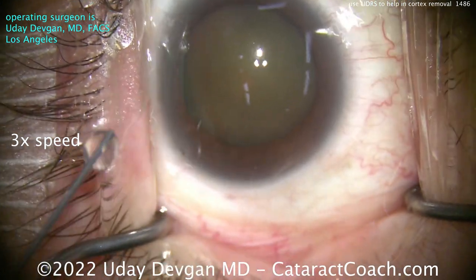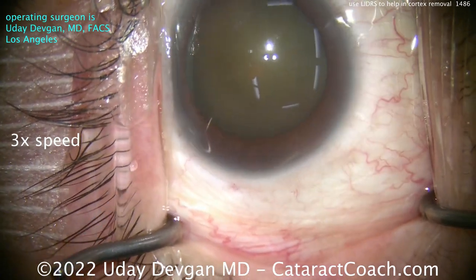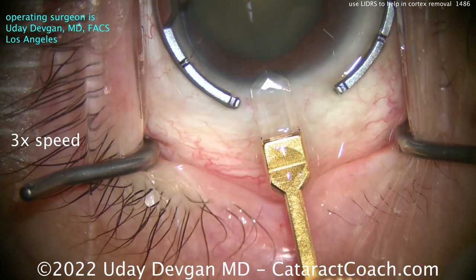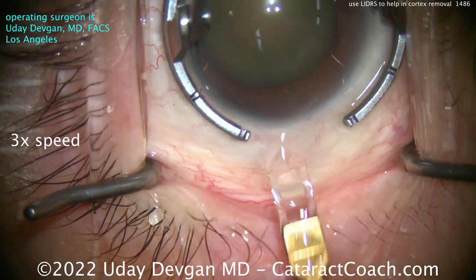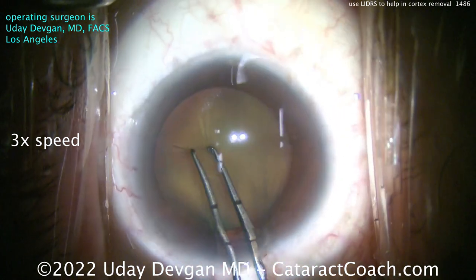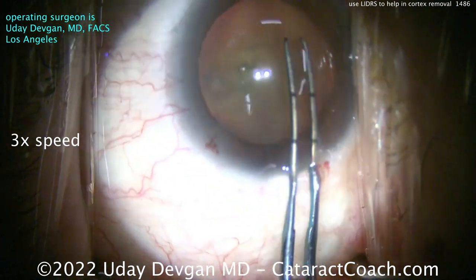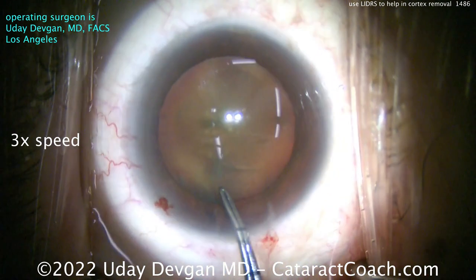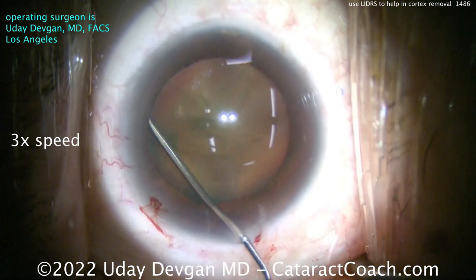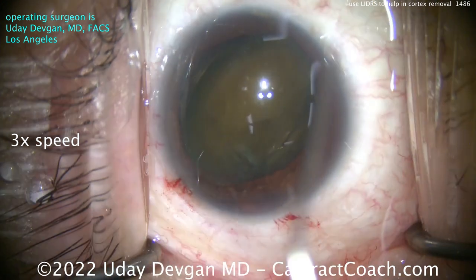Dr. Yosher taught us that, especially in these ultra-myopic eyes, and sometimes in eyes that are post-vitrectomy, you can have a situation where the infusion pressure from your device causes basically a reverse pupillary block. You push the iris onto that anterior lens capsule, causing the pressure in the anterior chamber to be much higher than the pressure in the posterior chamber — not posterior segment, posterior chamber. Because of that, you get a very deep anterior chamber, a very awkward situation. The way to fix it is simply to tent up the iris to equilibrate the pressure between the anterior and posterior chambers.